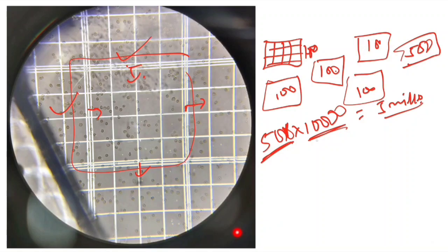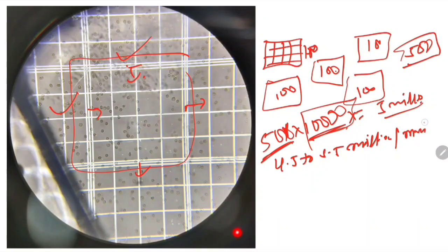Okay, but why are we doing this 10,000x? First thing, for RBC count we know the normal range is 4.5 to 5.5 million per cubic millimeter, or per microliter of blood. Yes or no? So this count is actually represented in cubic millimeter or microliter.